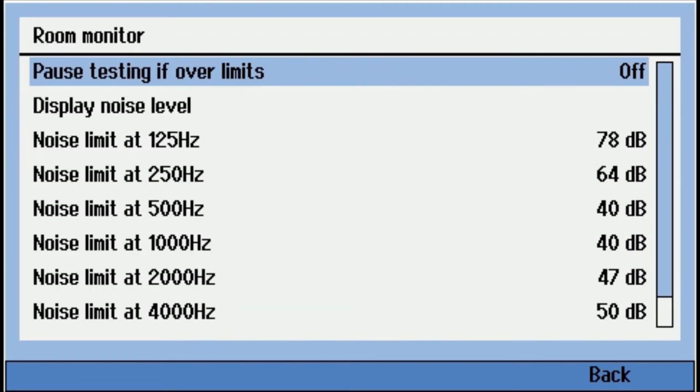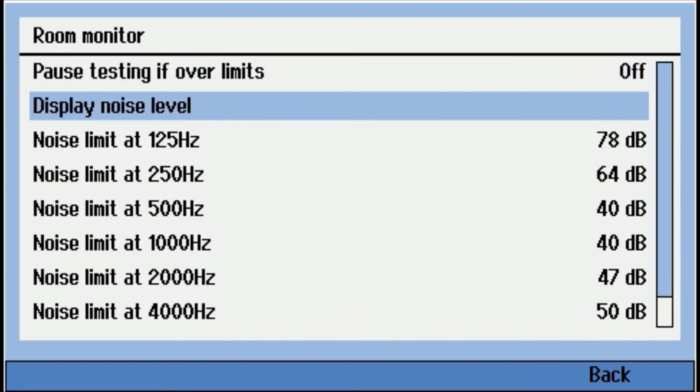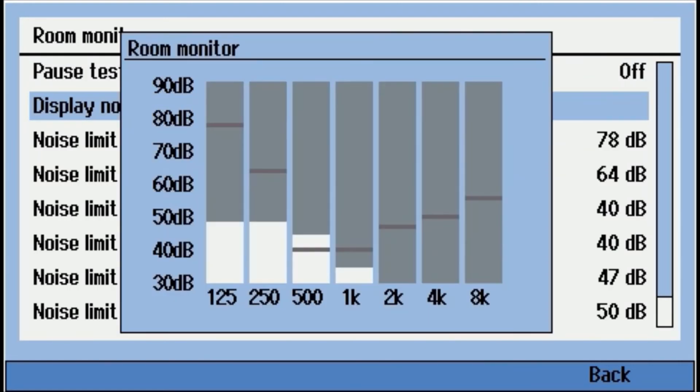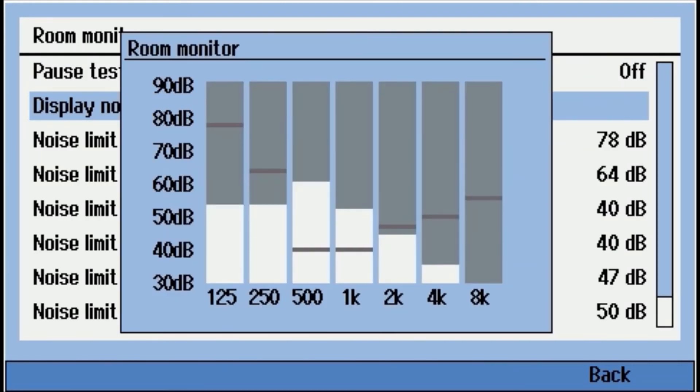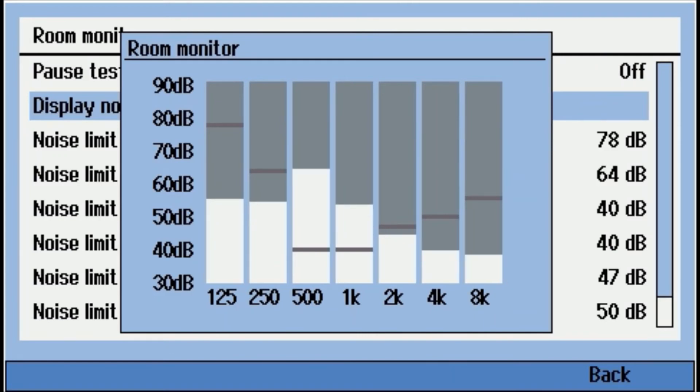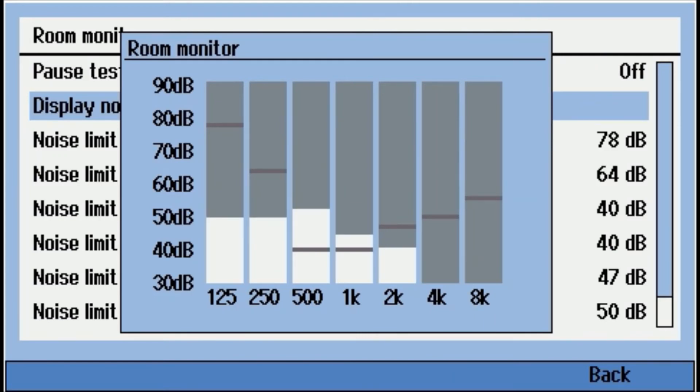And then if you go to display noise level, you can see this is the noise level going up and down as we're talking. The horizontal lines are the thresholds as they've been set. And then the vertical lines is the ambient levels at those different frequencies.